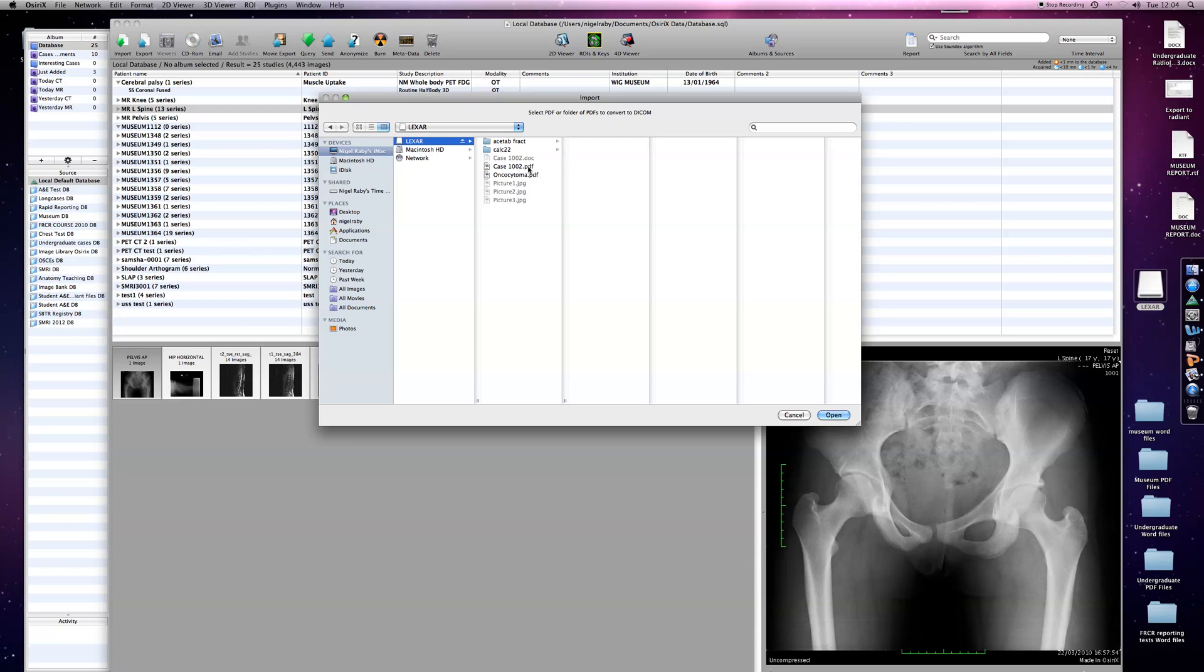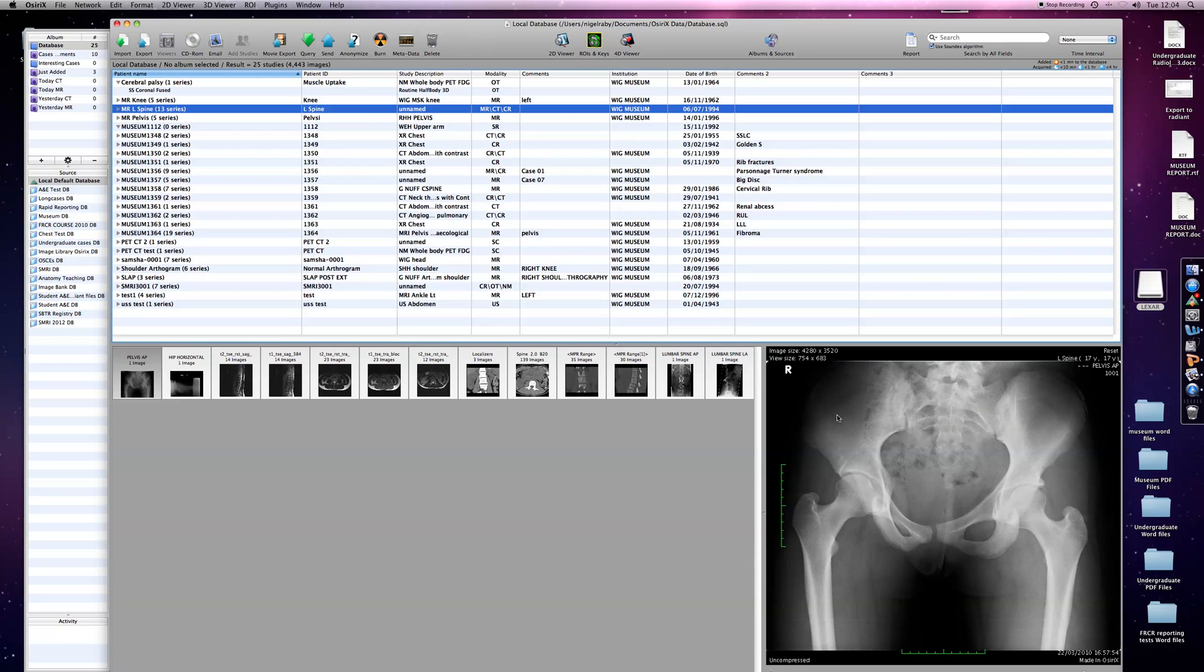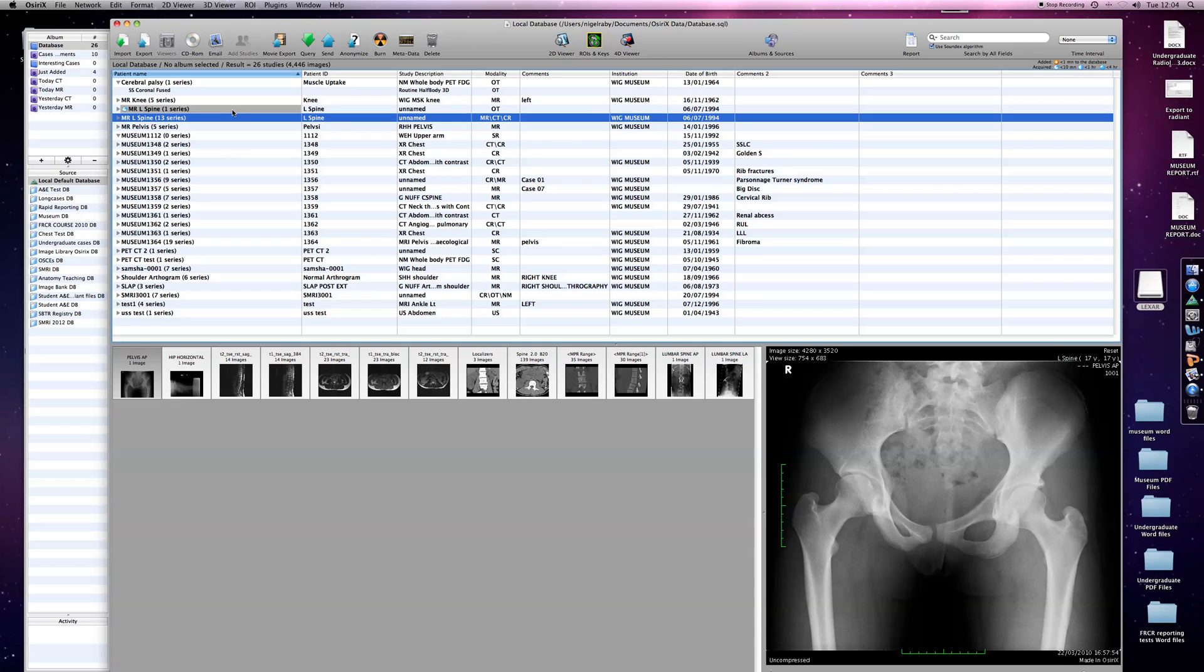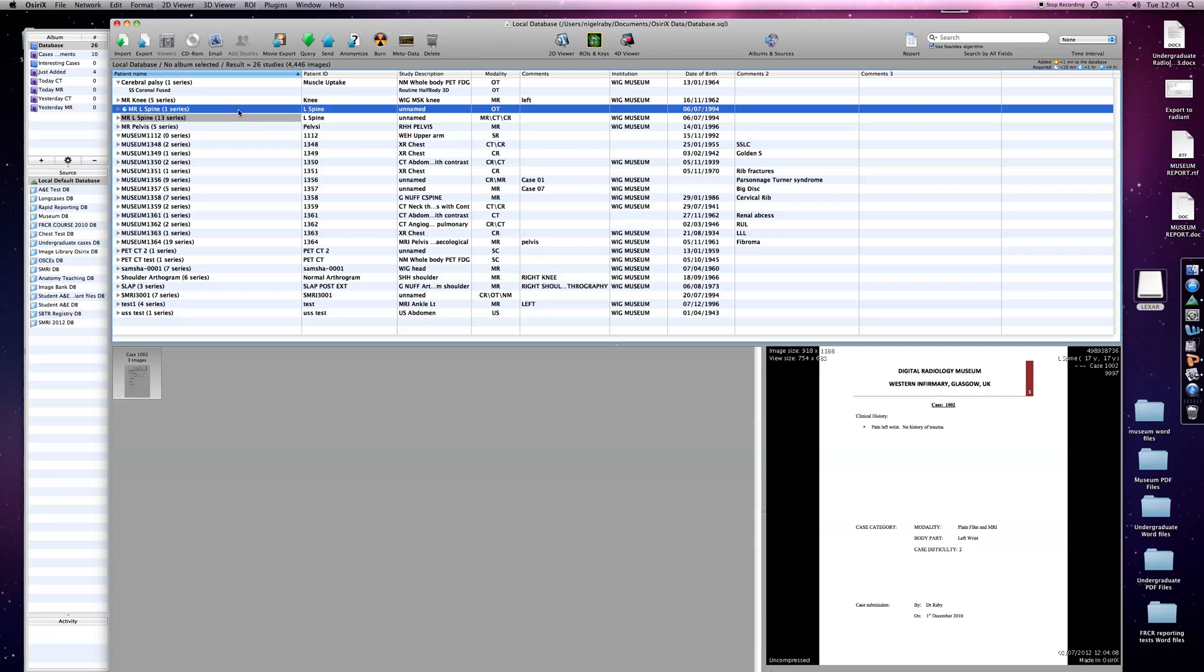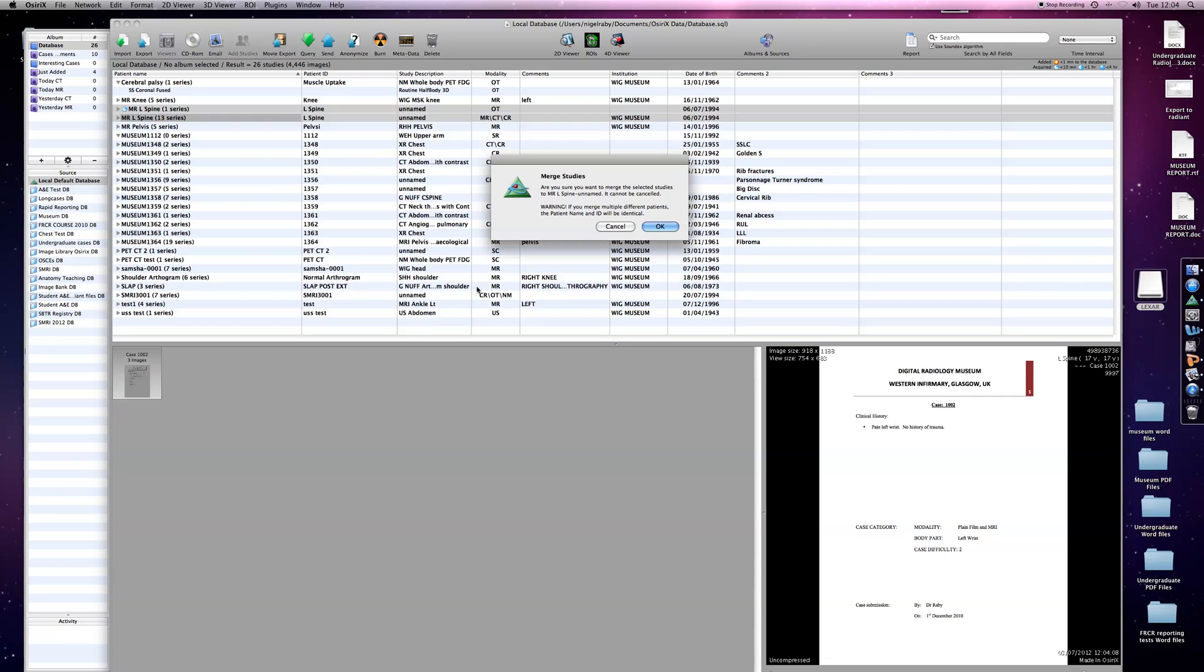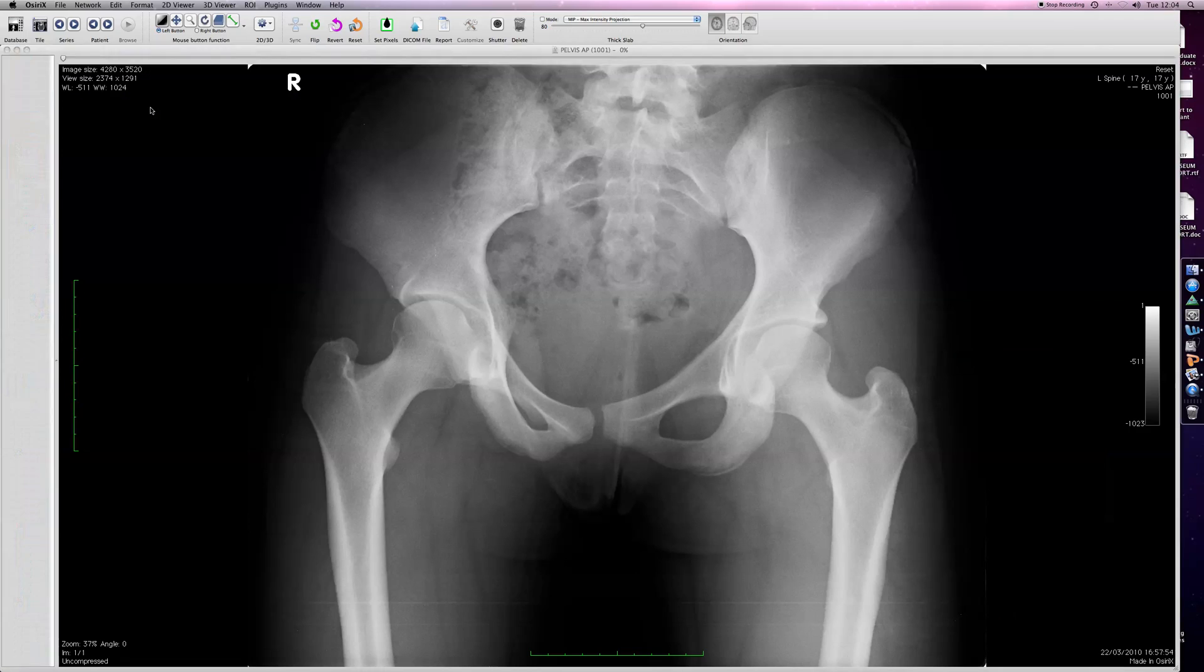Sometimes it automatically inserts into the case you want, sometimes it puts it adjacent to it. But again, as we did with multiple image files, all we have to do is merge those two. Use Shift and left-click to highlight both of them, right-click to bring up the submenu, and scroll to Merge Selected Studies. Say okay, and you'll see we now have a series of images within which there is also a text file.